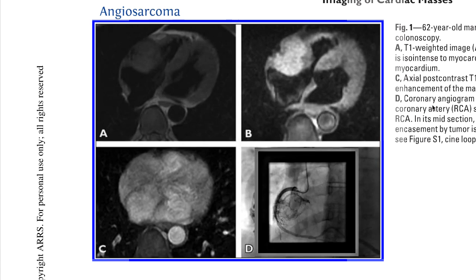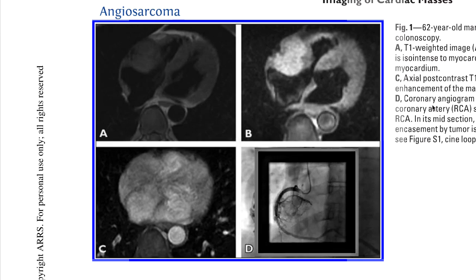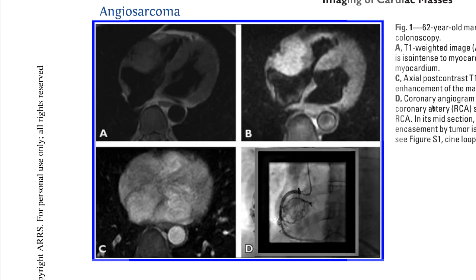Here's a case from Orla's paper. Again, this one's nice in that we have an angio, which shows you the intense enhancement of this tumor with the neovascular recruitment. This is pretty amazing.